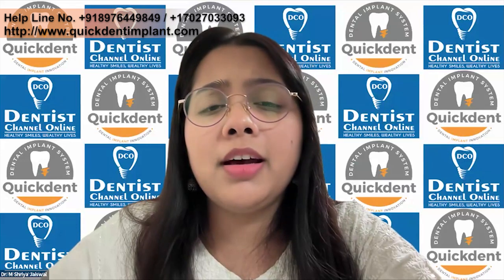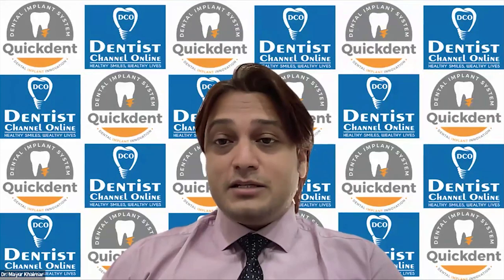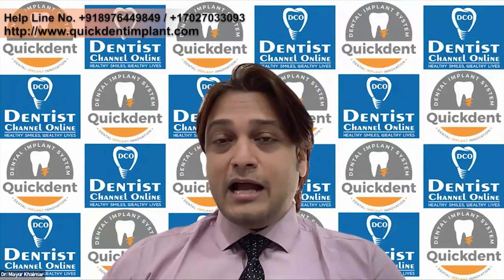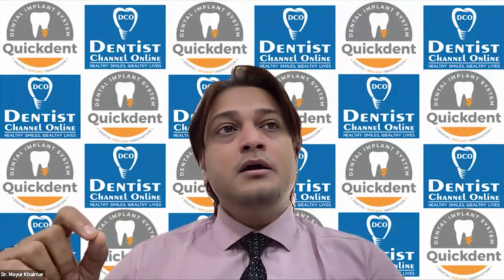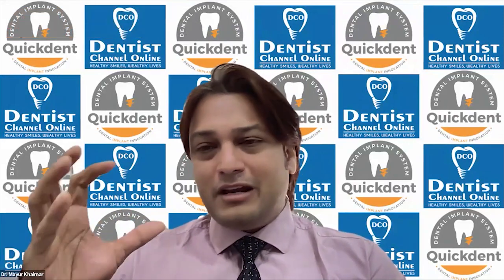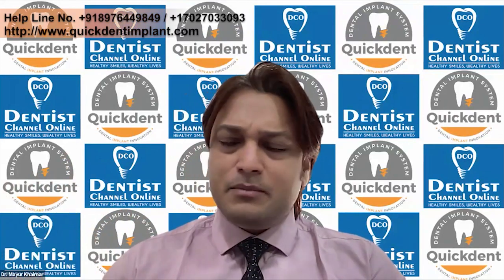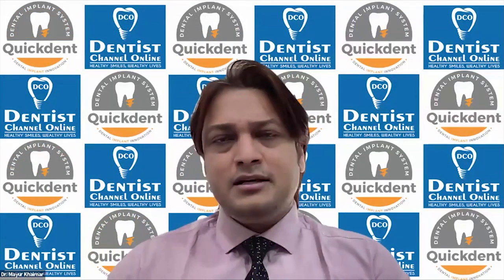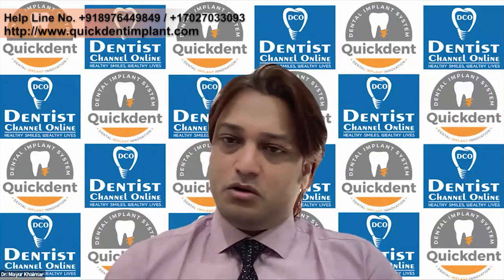Earlier, they used to say scanners are not reliable in full mouth implants. Yes, because previously the scanners never used to give desirable results, especially in the surgical areas. Wherever the blood was there, there used to be stitching issues and so many things used to happen. But now, because I'm using a good scanner, these things have become significantly less. In the last 2 years, there has been tremendous change in the digital scanning protocols. True. A lot of updates have been there.